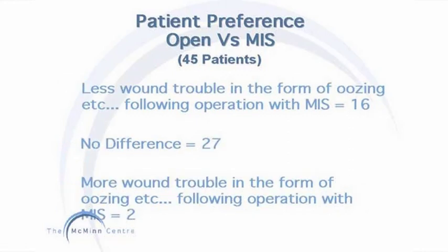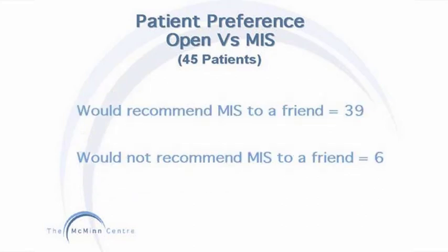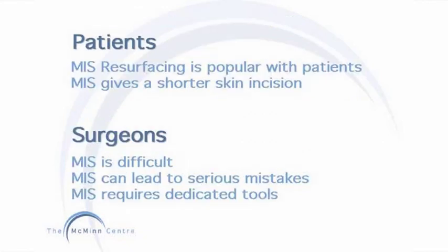16 patients experienced less wound trouble, but the majority felt that there was no difference in the operated wounds. 32 patients were aware that the appearance of the scar was better and therefore more preferable. 39 out of 45 patients would happily recommend the mini-incision procedure over the traditional approach. For patients, mini-incision surgery is an attractive option when having a Birmingham hip resurfacing.